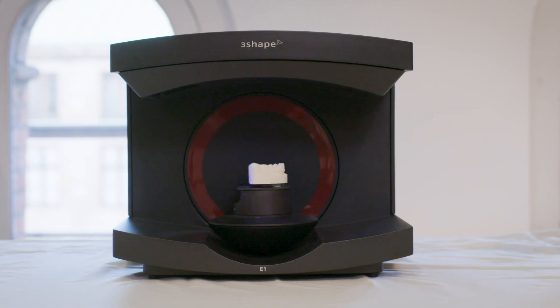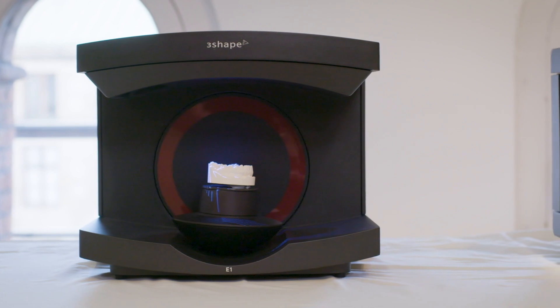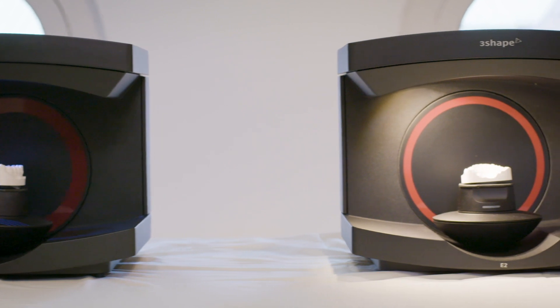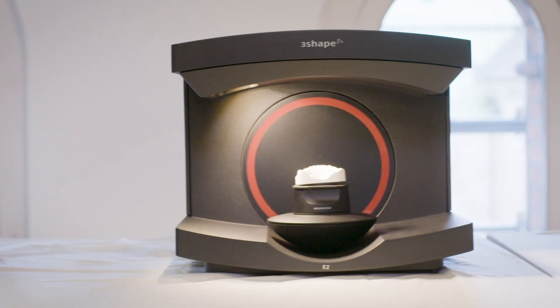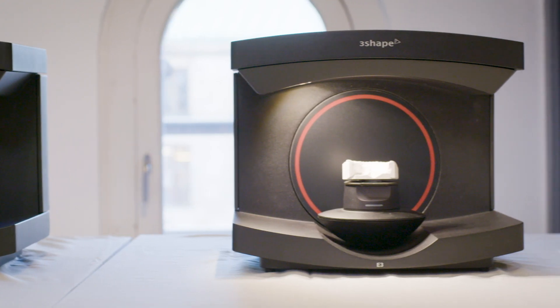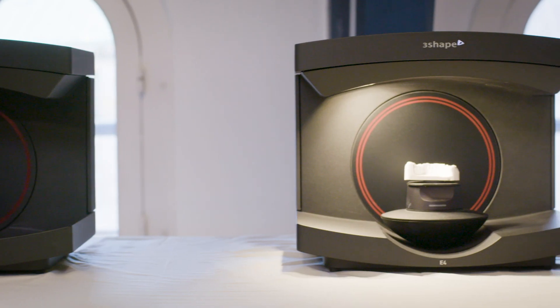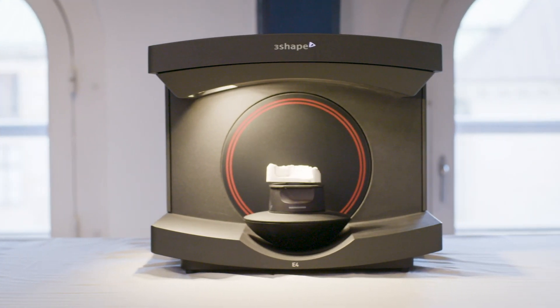To sum up our portfolio: we offer the e1 red scanner, which is ideal for labs new to digital, transitioning from the analog to digital world. The e2 red scanners are good for texture scanning, required for example in designing removable partial dentures. The e3 red scanner offers implant bar accuracy and now with even higher speeds to boost your productivity. And finally, the premium e4 red scanner with ultra high speed and accuracy.